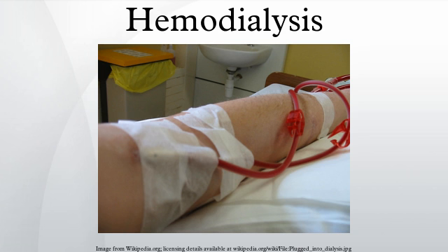As medical reimbursement rates begin to fall even more, many dialysis clinics are continuing to operate effectively with reuse programs, especially since the process is easier and more streamlined than before.